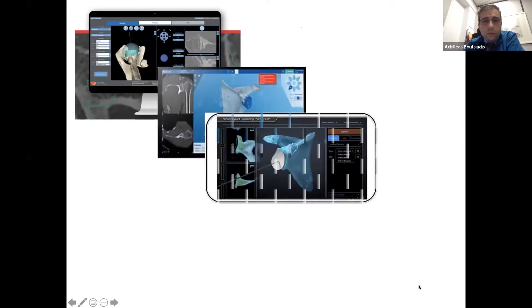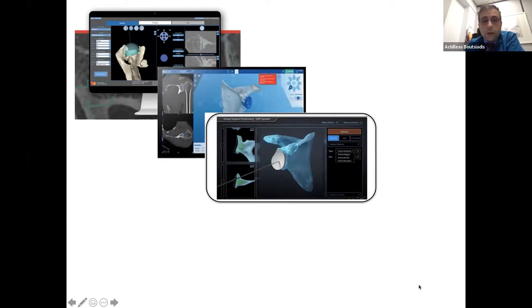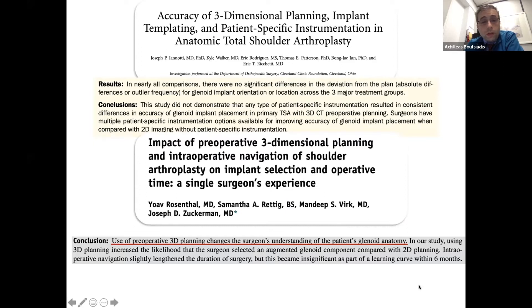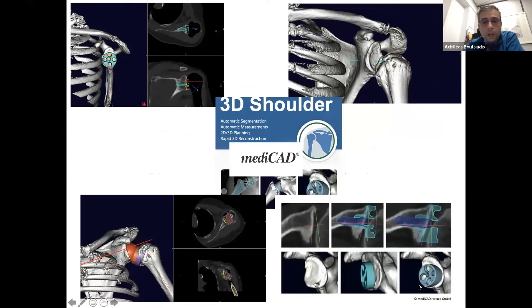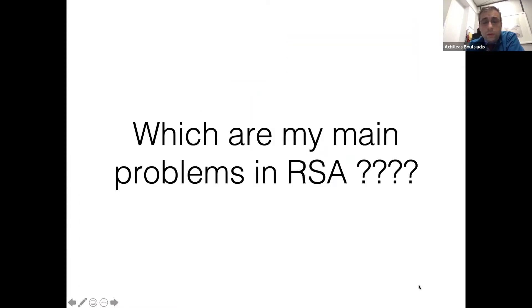Different pre-operative planning softwares exist in the market, but they are each specific to one company's reverse shoulder arthroplasty. With MediCAD, this software seems to change the understanding of the patient's anatomy, mainly from the glenoid side. All publications show that planning software changes the way the surgeon thinks and also helps young surgeons operate better and understand the anatomy and pathology. I have been using MediCAD for about two years, and it has a wide range of available reverse shoulder arthroplasty implants from the market.